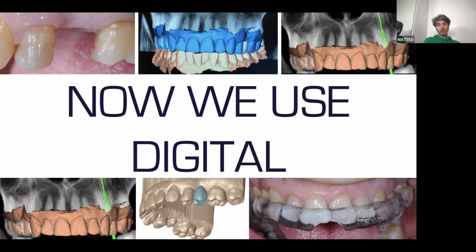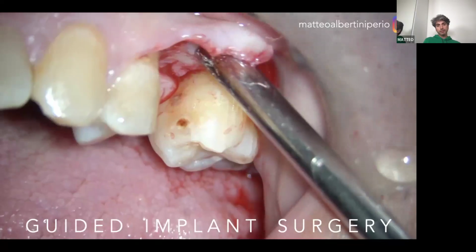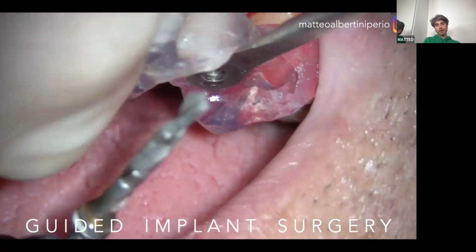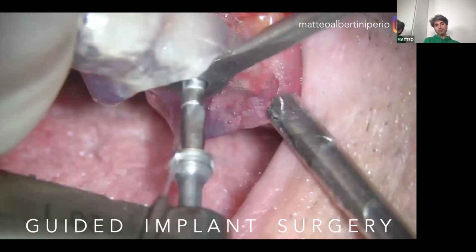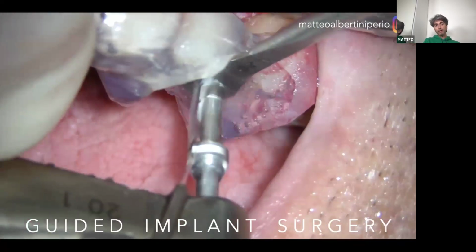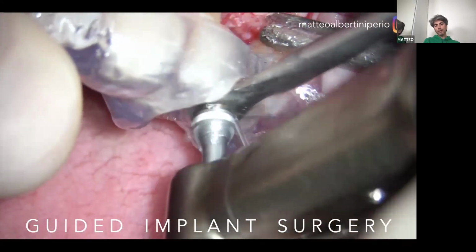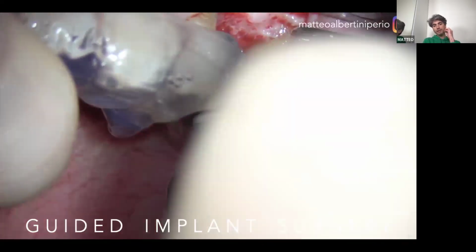Okay. So in this simple clinical case, now we're preparing the implant bed out of a surgical guide that is digitally planned.